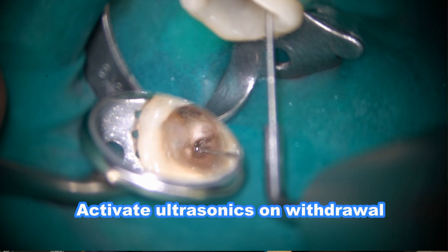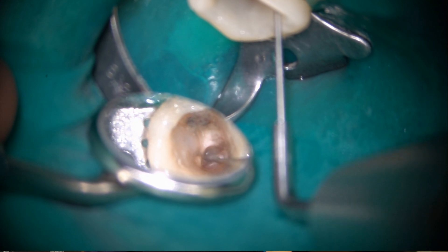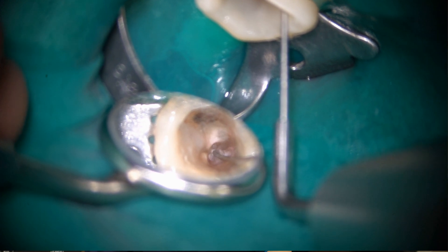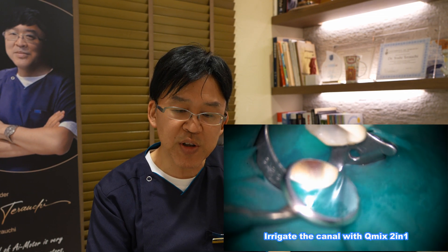I activate the ultrasonic only on withdrawal. It is very important to feel a sticky sensation when activating the ultrasonic. It takes some time until you lose the sticky feel. I still feel sticky, so I have to continue doing the same thing.